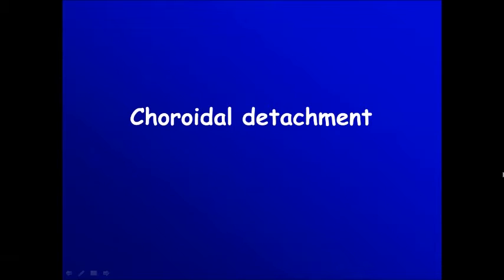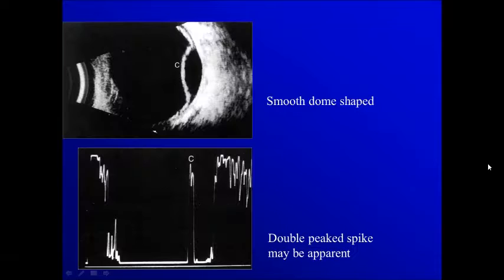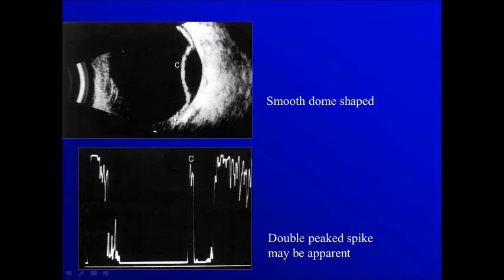In this part, I want to cover the subject of choroidal detachment. Choroidal detachment usually appears as a smooth dome-shaped area. You can follow it here — continuous with the choroid on contact with the wall. This is the normal area, but here it becomes detached with clear fluid underneath.